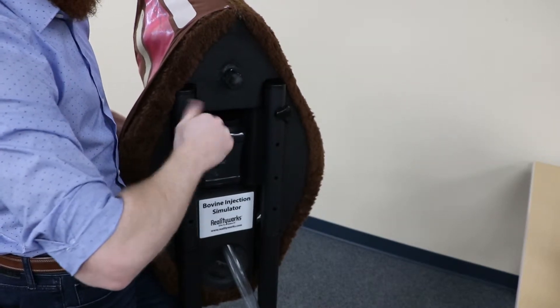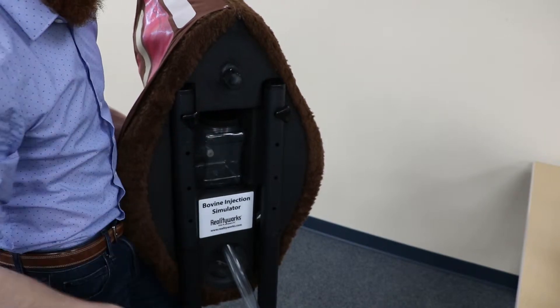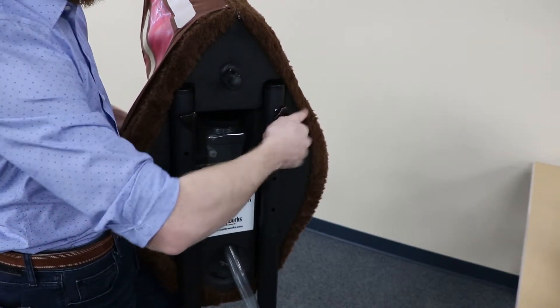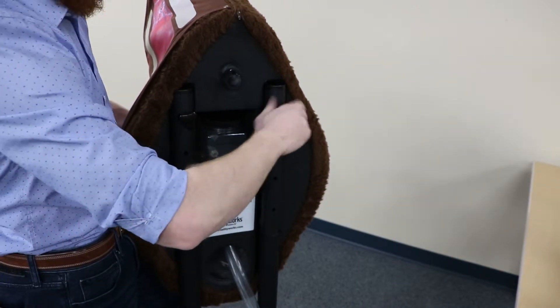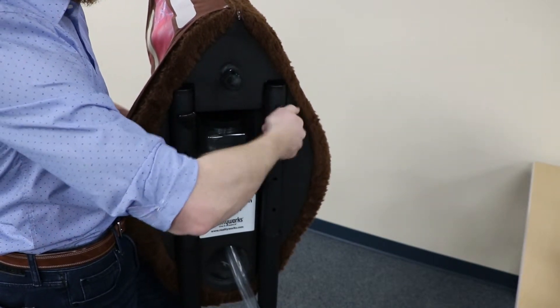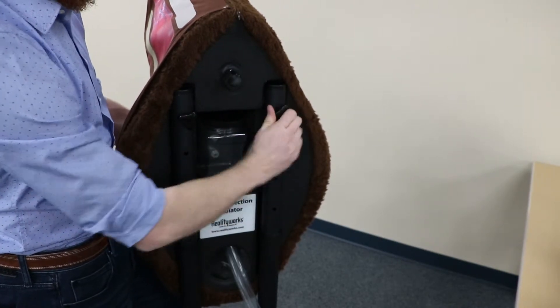Then we're going to tighten that until it snugs up against the upright of the base, and that side's secure. We'll go back to this first side and tighten that one as well — just going to snug that up, just like that.